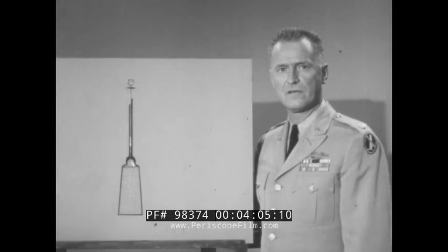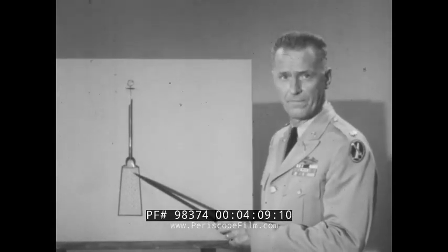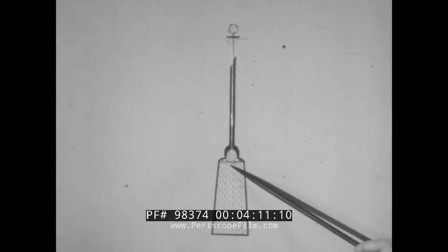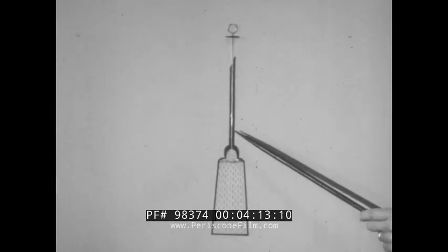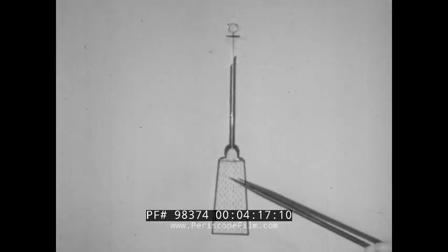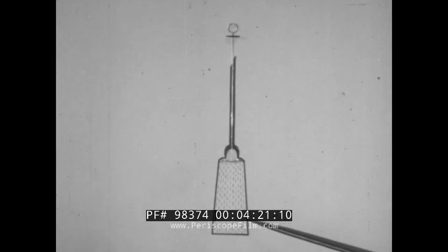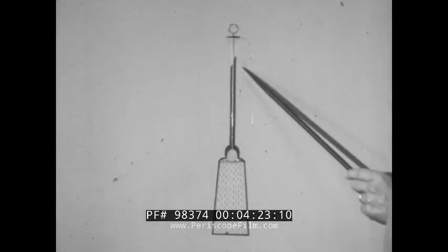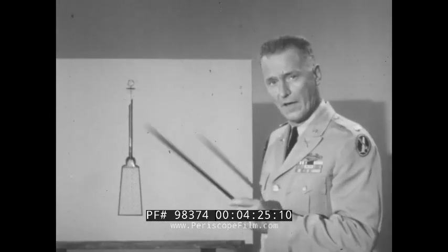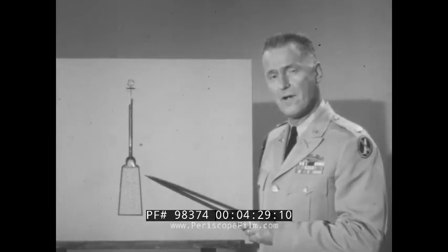The liquid atropine is sealed in the tube by a soft metal diaphragm. There's a wire called a stylet running through the needle. The stylet is used to puncture or open the diaphragm so that the liquid may escape from the tube through the needle. Here's the procedure for breaking the seal or the diaphragm.